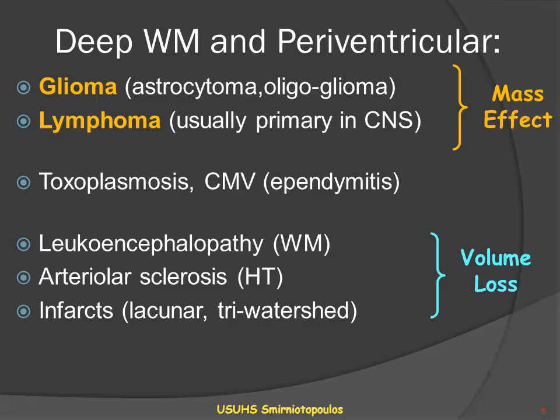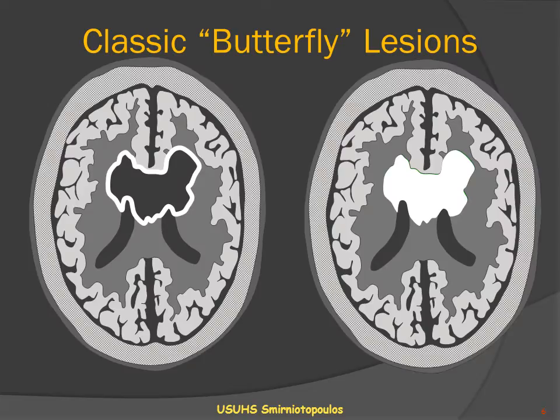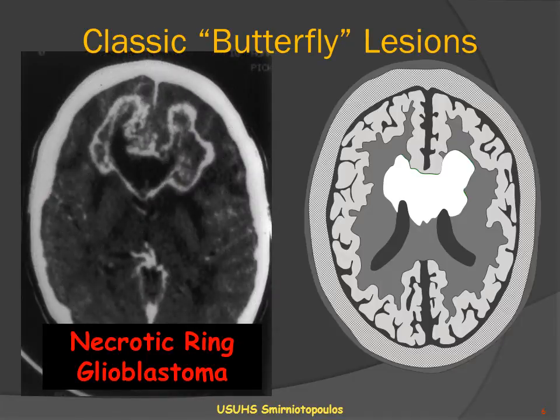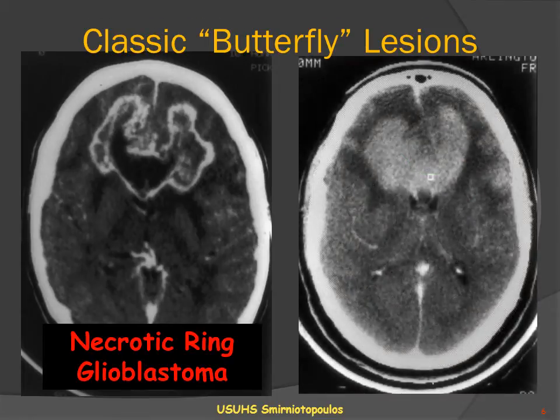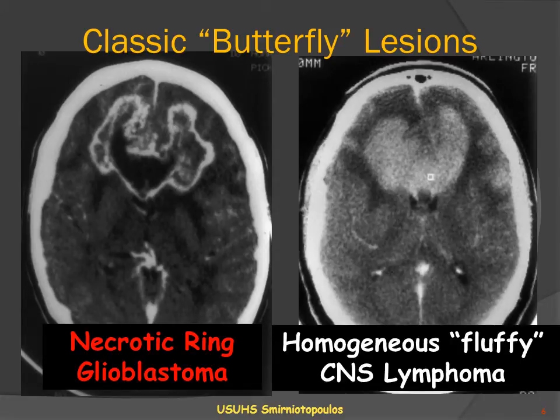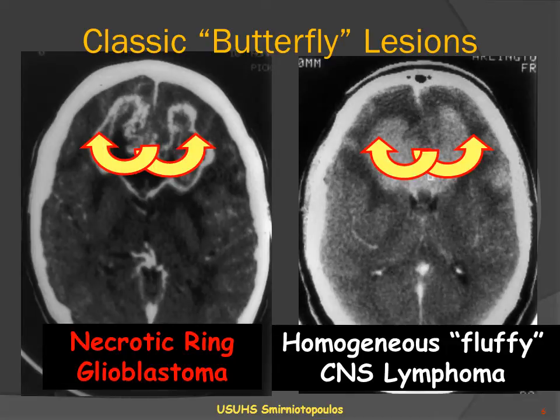However, these lesions classically are associated with volume loss. Of course, these small vessels affected by hypertension may produce hemorrhage in a similar location. The classic butterfly lesions include the necrotic ring-enhancing lesion of a glioblastoma multiforme, the highest grade of diffuse astrocytoma, as well as the fluffy hyperattenuating, relatively homogeneous lesion for primary CNS lymphoma. Both of these lesions microscopically infiltrate and follow along the white matter tracks as they pass from side to side through the corpus callosum.